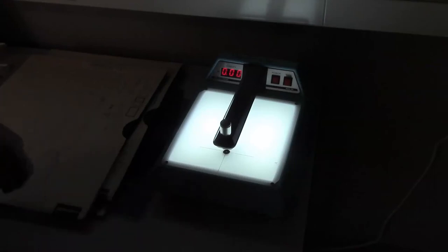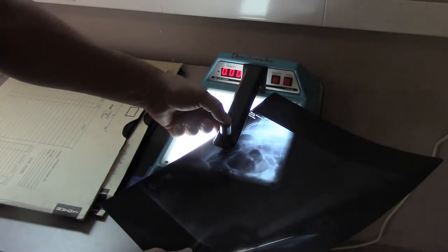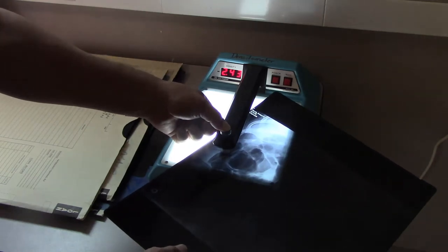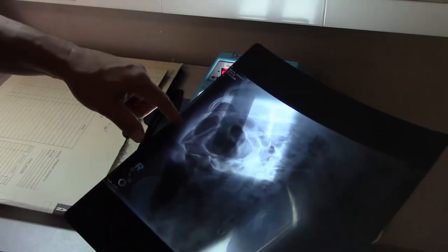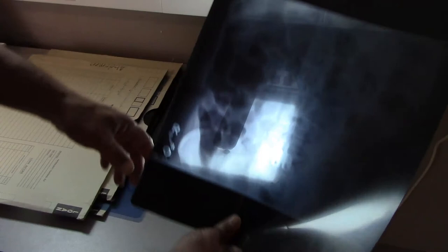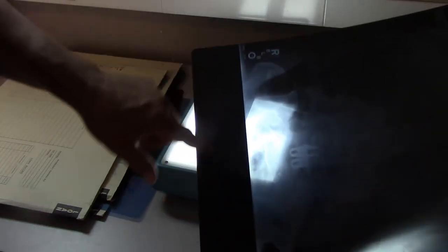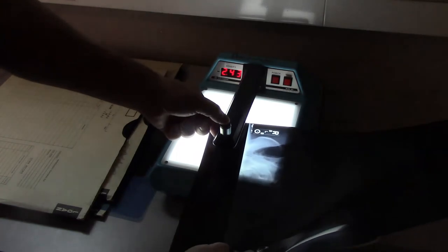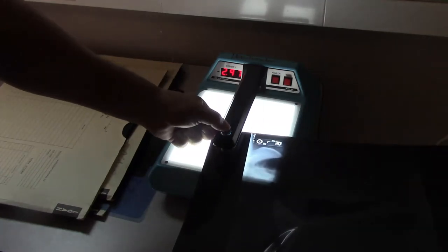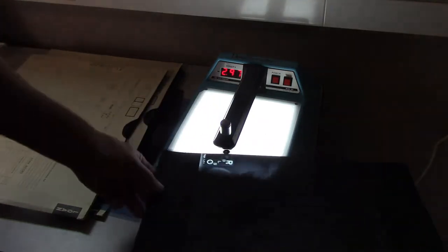Let's take this image. We've got some areas here that are dark with bowel gas. If I'm going to measure one of these areas, well that's got an optical density of 2.43. So that's really really dark. This is one of those cases where less than 1% of the light is getting through. What if we go down here to this black area and take a look at that? Turns out it's going to be pretty dang high - 2.97 is what that's telling me.